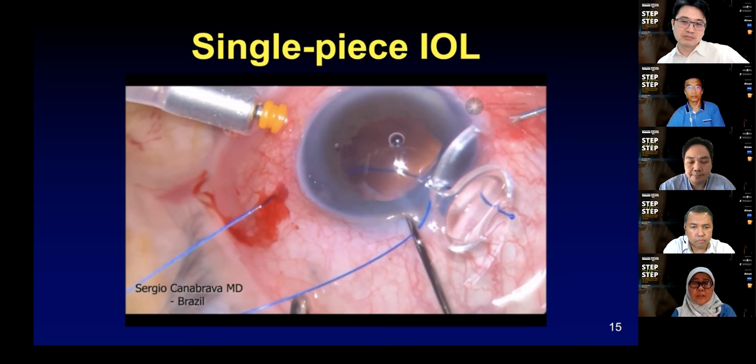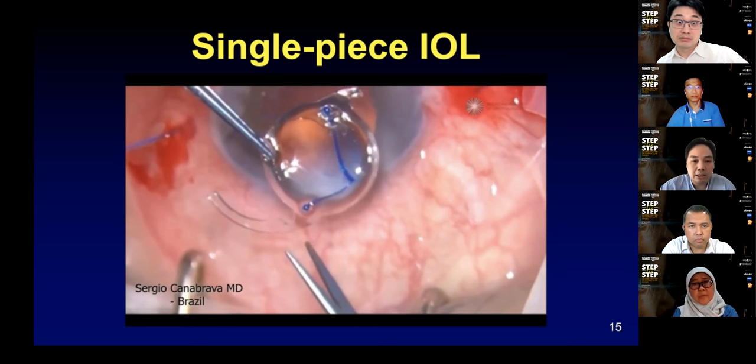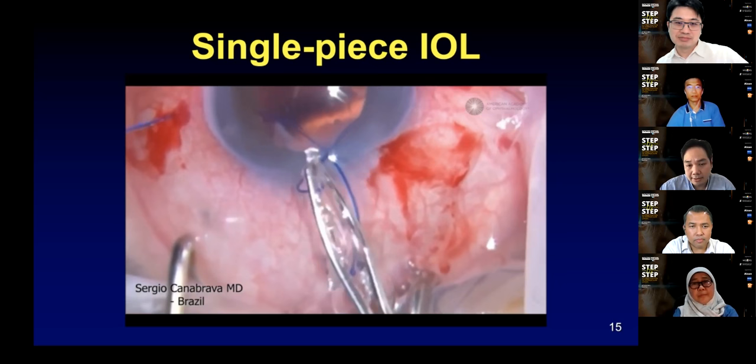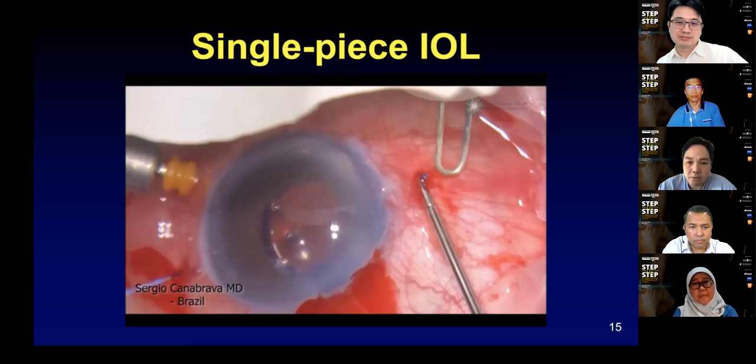I will illustrate that later to get it at the 180 degree position, as Dr. Noliza has highlighted. Now he cuts off the haptics because he feels that there's a potential for the haptics to cause some iris chafing. So he said, you don't need the haptics, it serves no function. So he cuts them off, folds the lens and inserts it this way. In this way, you get a 2-point fixation, and the proline suture is then cut to appropriate length. And I'll highlight what length you need to get a nice bulb.